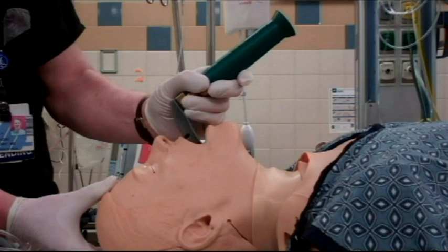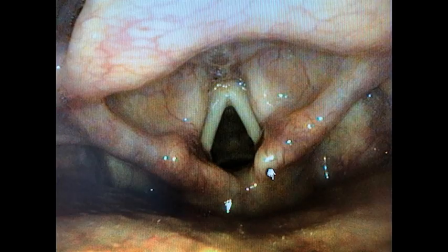The tip of the laryngoscope blade will be in, or at least very near to the vallecula. When you lift the laryngoscope blade a second time in exactly the same direction as before, that is, diagonally upwards to where the wall meets the ceiling, in the large majority of cases, the epiglottis is going to elevate and it will reveal the true vocal cords with the glottic opening sitting between the true vocal cords.